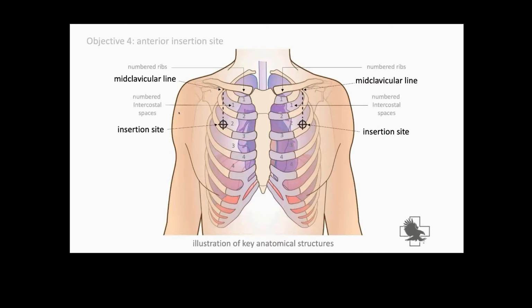Generally speaking, in those moments, I will tend to try to place the catheter slightly more lateral. Given the option between being a little bit medial and a little bit lateral, I will tend to place it more laterally. That being said, I do recognize that it's hard to always know exactly what midclavicular is.